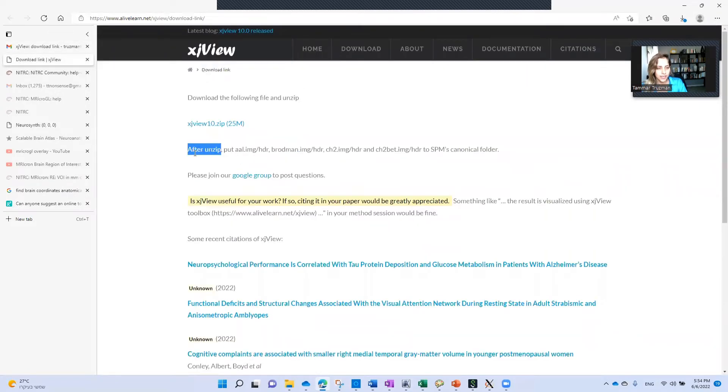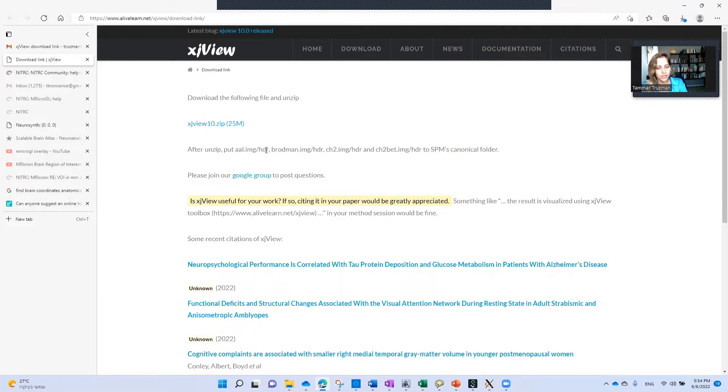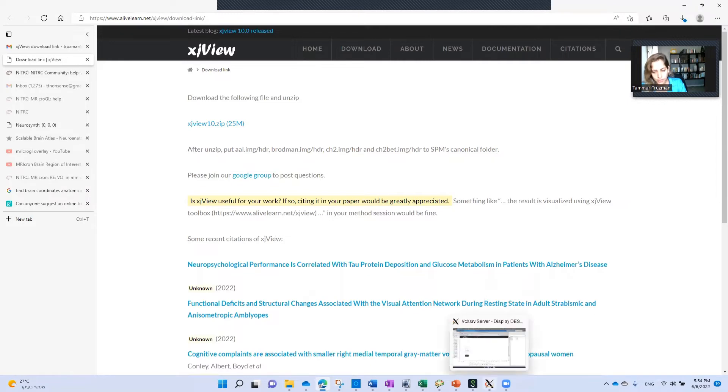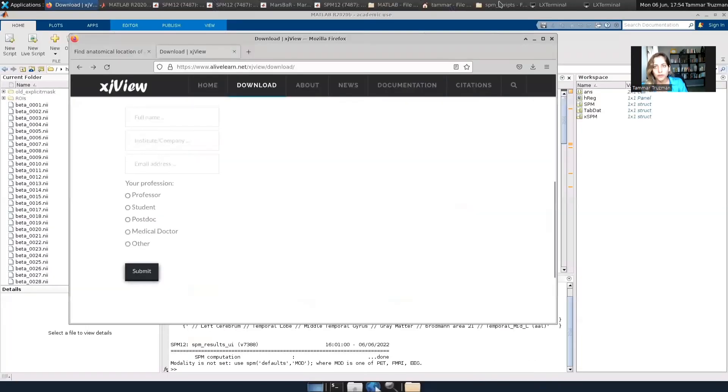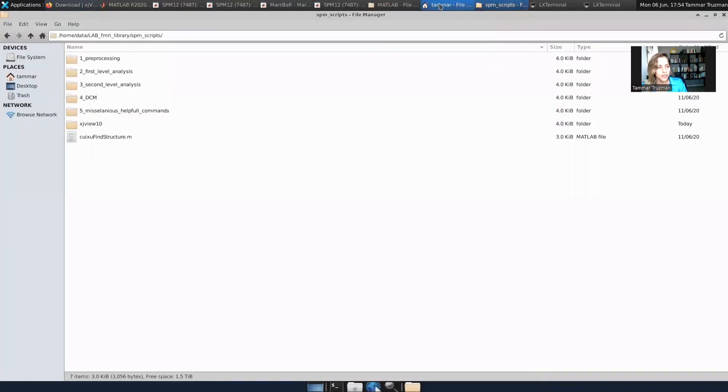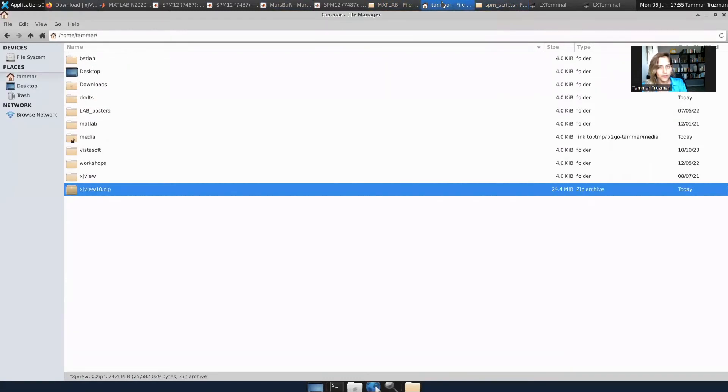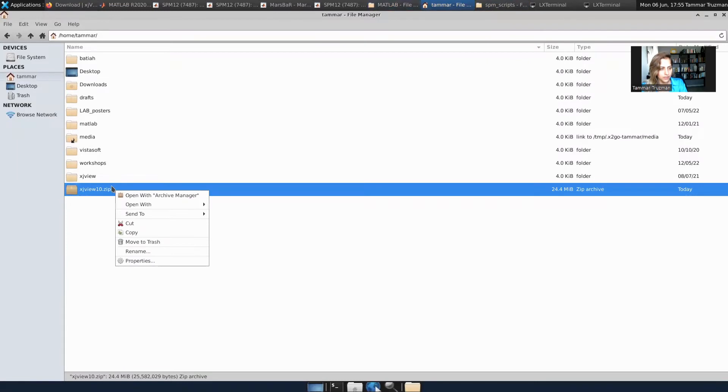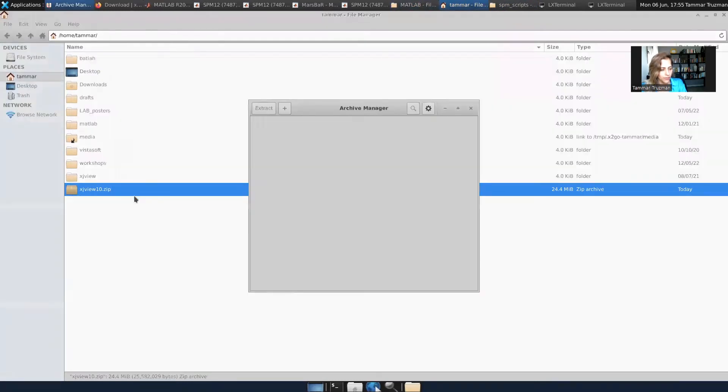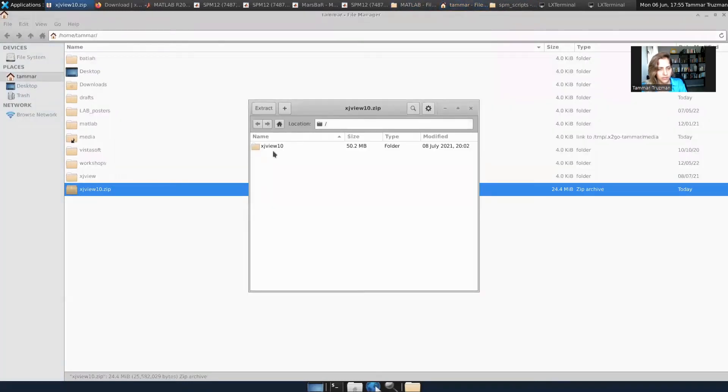And as they say here, after unzip, put AAL image and header, Brodmann image and header, et cetera, in SPM's canonical folder. So after I downloaded the folder, I first extracted it, unzipped it. I'm using Linux here, extract.